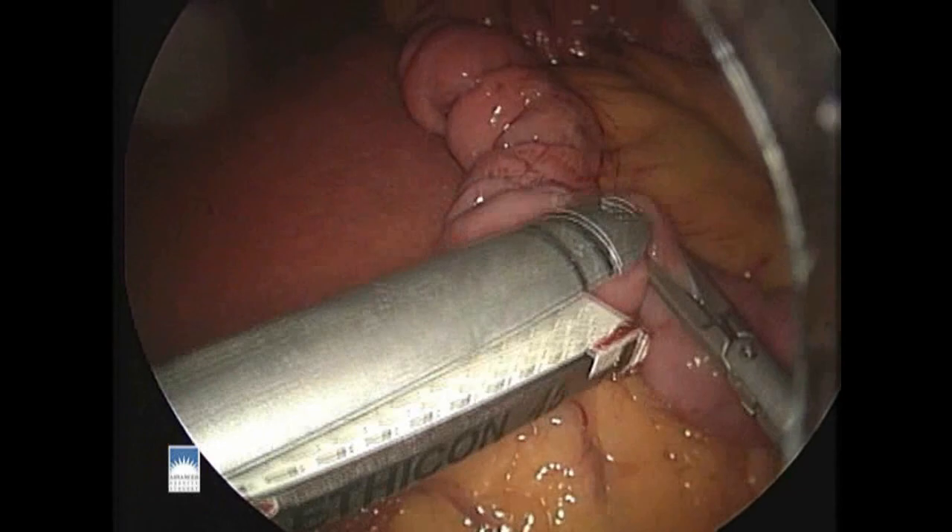This video will demonstrate our technique for the laparoscopic Roux-en-Y gastric bypass. The first step is to measure and create the Roux-en-Y limb.